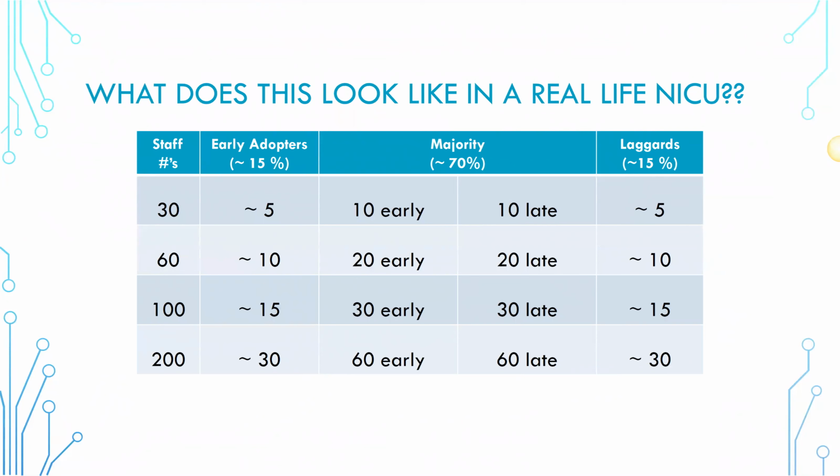In the early 2000s, the use really increased in the US, especially with the combination of aEEG with the CoolCap device. And so we saw a big resurgence of popularity, and specifically we saw the use of the CFM. That was actually a qualifying part of the CoolCap eligibility to be in that study. And so we have now 3 types of monitors available. One of the first decisions is what device do you want to buy for your unit? We have standalone devices, and the only standalone that's currently being sold is the OBM.